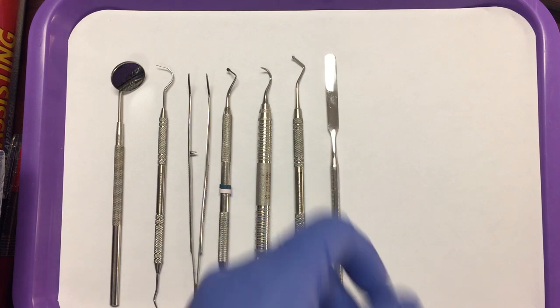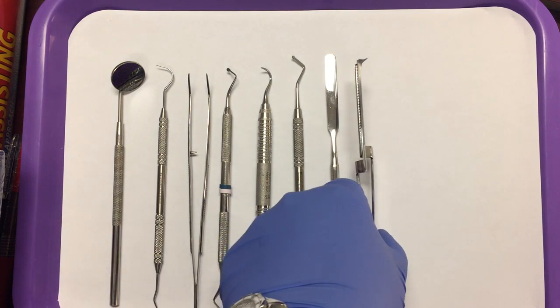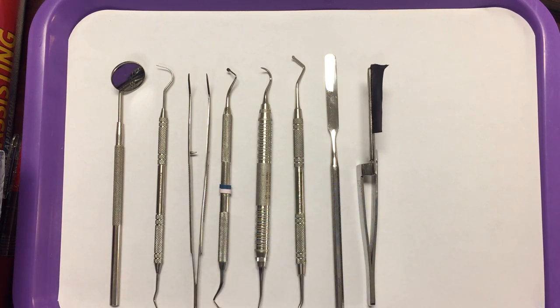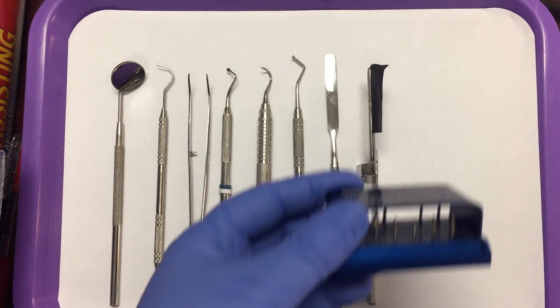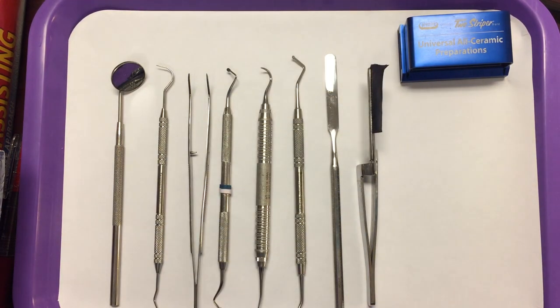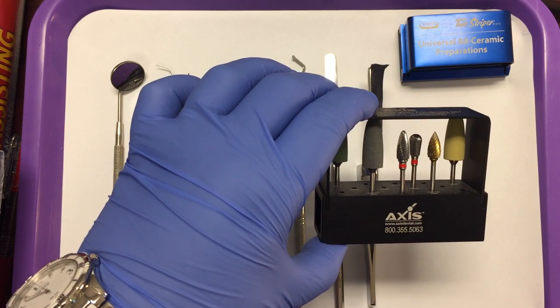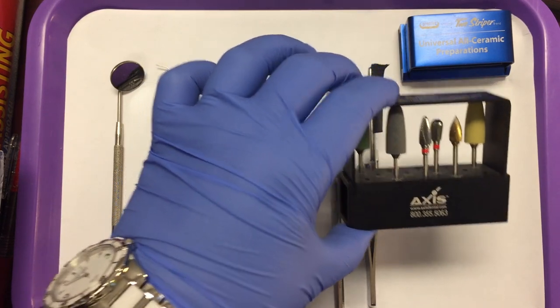We have our cement spatula to mix our cements. And then we have our articulating paper holder and paper. We're going to put the proper burs that we need. On a preparation tray, we need diamonds to prepare the teeth, and we need acrylic burs for when it comes time to make the temporary restoration.